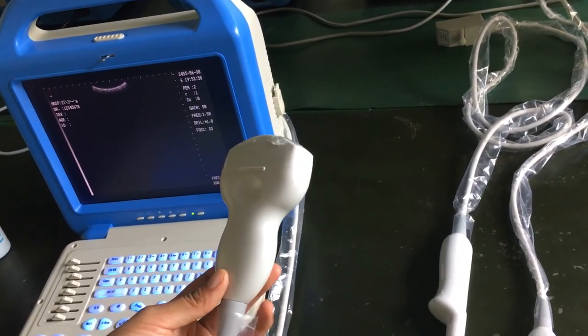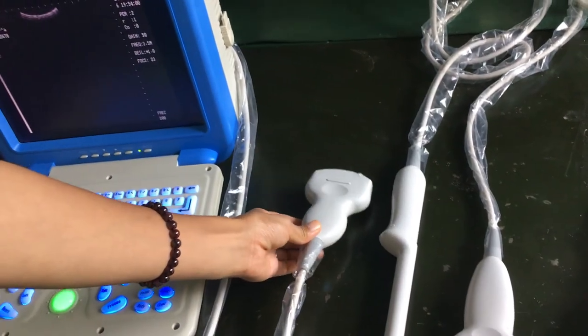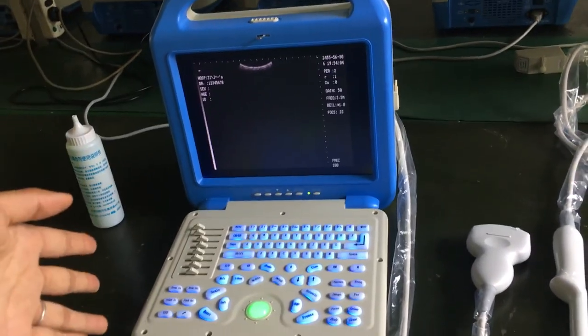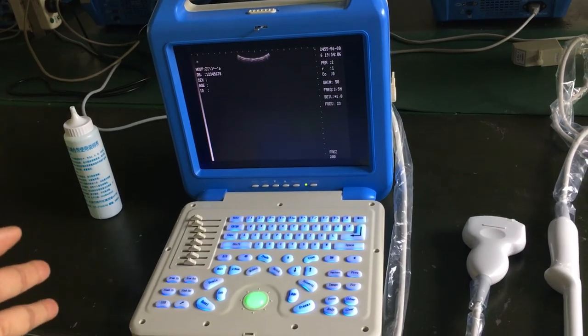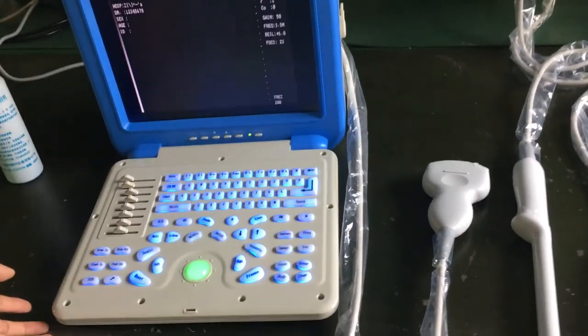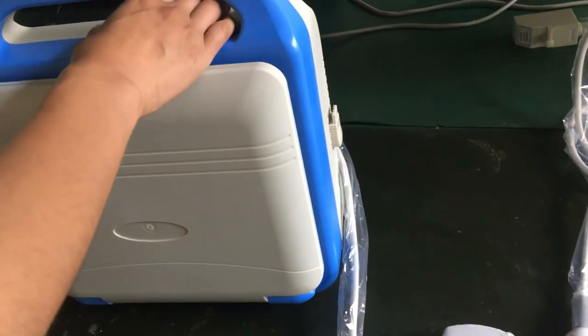You can check the liver, kidney, and stomach. This machine comes in two different colors — today we show the blue color, and we also have a white body shell version.